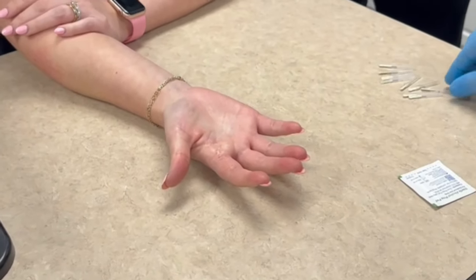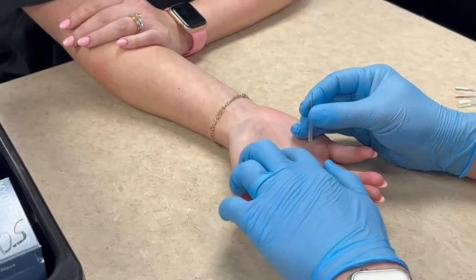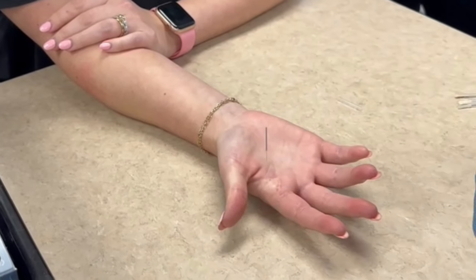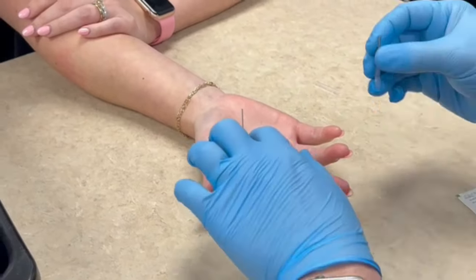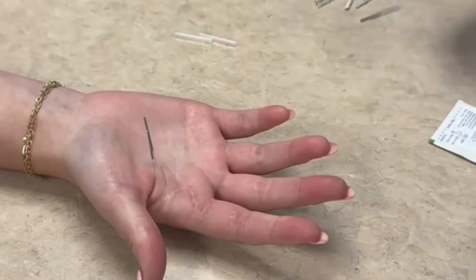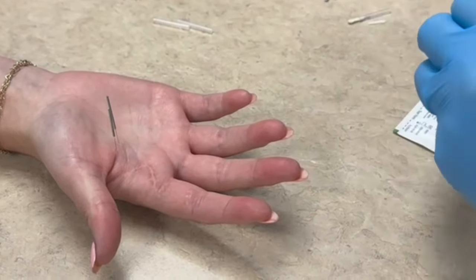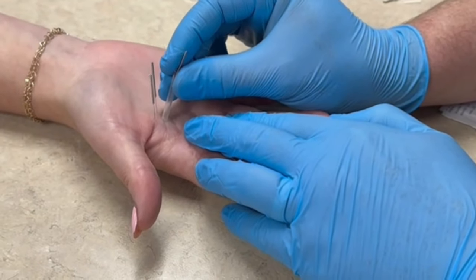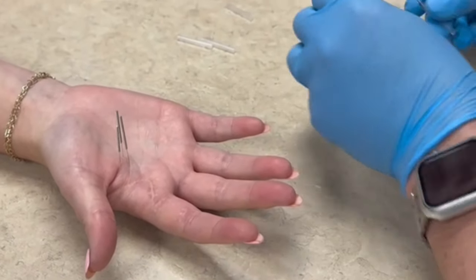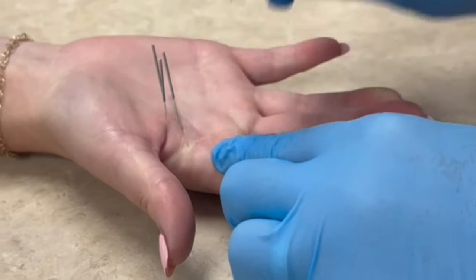Another technique you can do for scar is just tap the needle directly into the scar tissue. A lot of times you don't have to go crazy deep. Are you going directly over it or kind of on the side? No, I'm trying to go directly into it, because this is a well-healed scar.